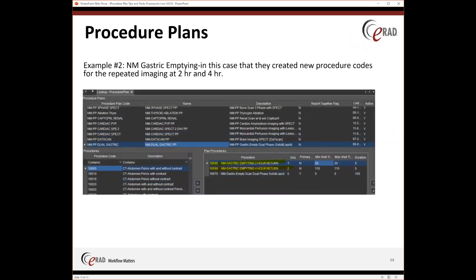This one is a NucMed gastric emptying. This is one where you can see it has more than two exams — it actually has three. This is where it gets a little tricky doing your min and max times, and I find that this takes some testing to get it exactly as you'd want it, because you have to decide what your minimum wait time is from your first exam when talking about your third exam. The second exam — sequence number one, the two-hour return — is set at a 30-minute minimum and 30-minute max, where the four-hour return is set at 115 for each. It's a little different scenario and does take some playing around. This is when your test system comes in super handy.